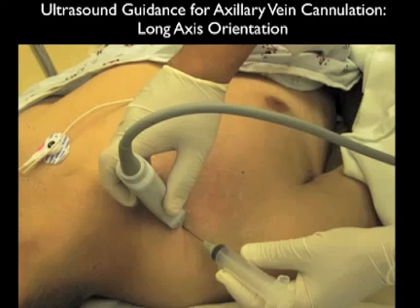Now I like to have the probe positioned so that the marker on the probe is oriented lateral. Thus the needle will come in underneath the indicator and progress directly underneath the probe as it courses from the skin down to the axillary vein. And it's important to keep the needle in plane underneath the probe at all times so that it can be visualized as it goes down to the vessel.